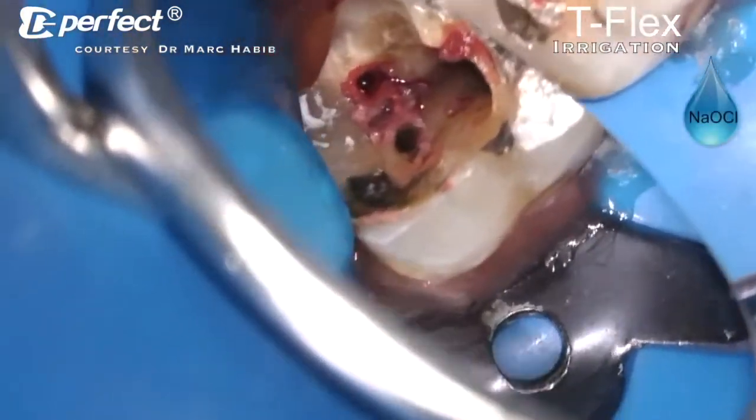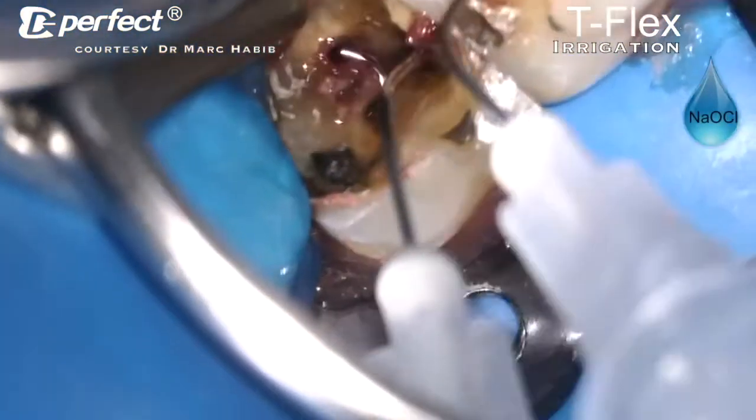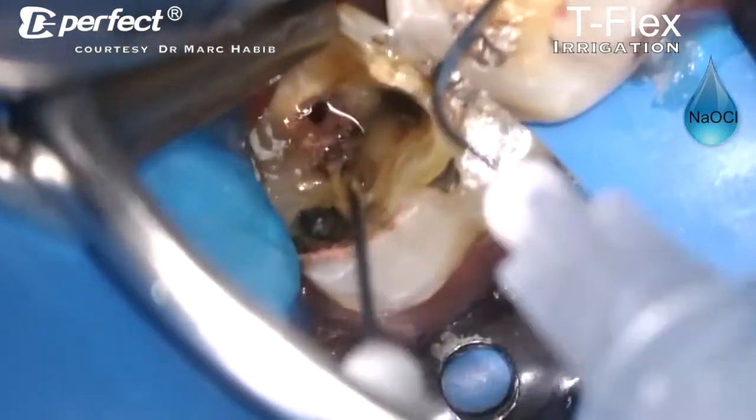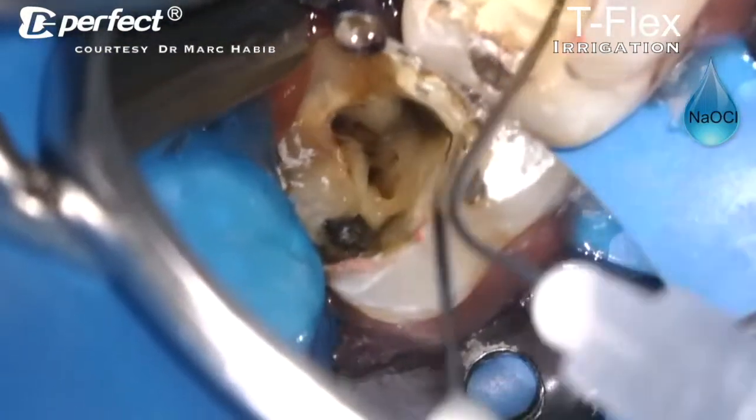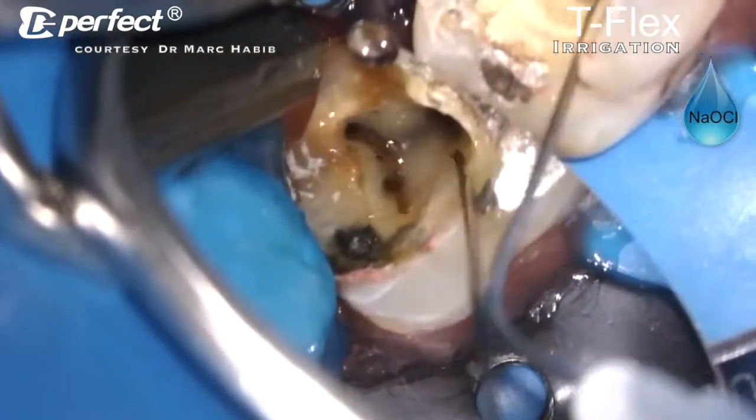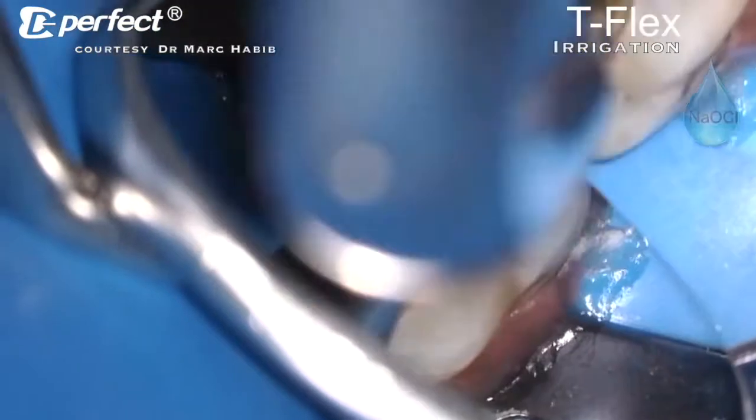It's time to do the irrigation to clean the debris from the pulp tissue that was removed from inside the canals, and to be able to assess the access cavity after doing this coronal flaring for the 3 canals.